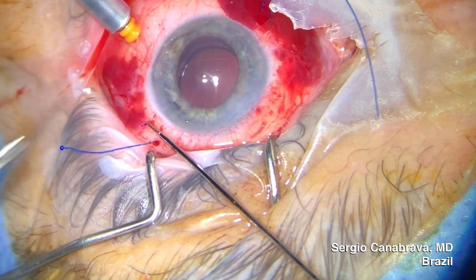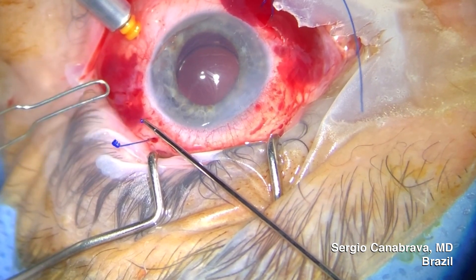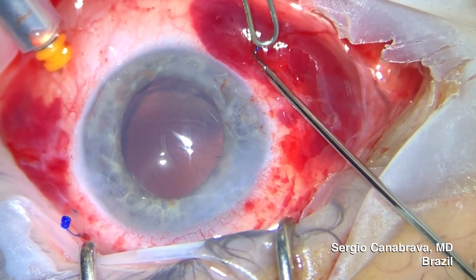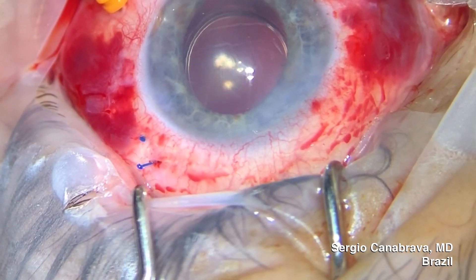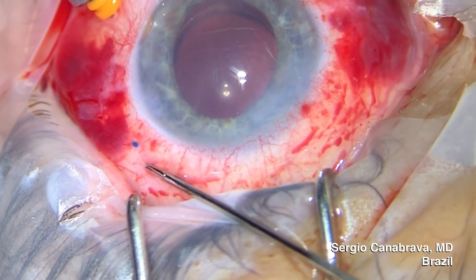We then start the flanging process. We first flange one side and then the opposite side. We repeated the procedure on the third and the fourth flanges. Once done, arrange the flanges in order to adjust them to the sclera.